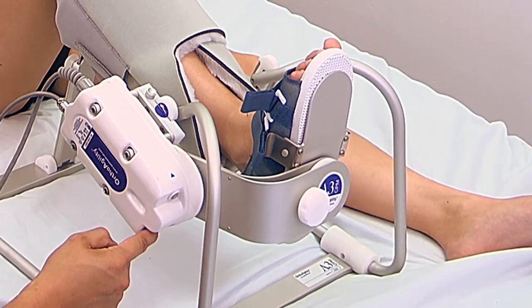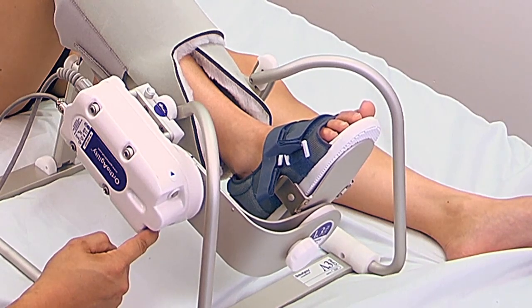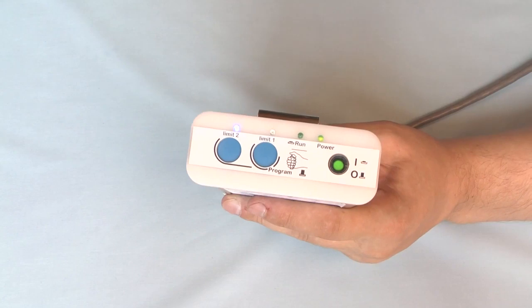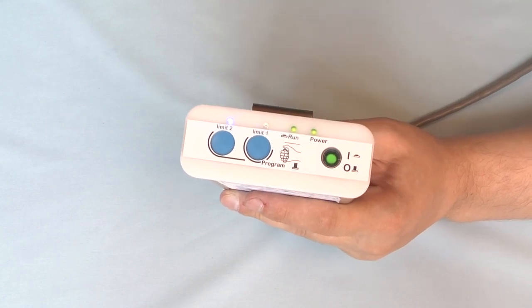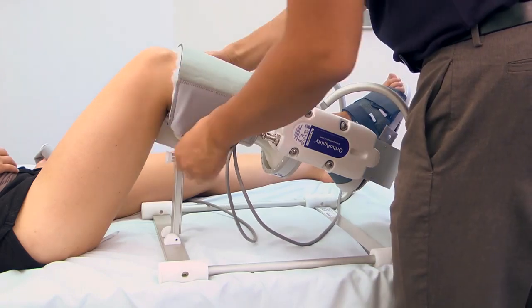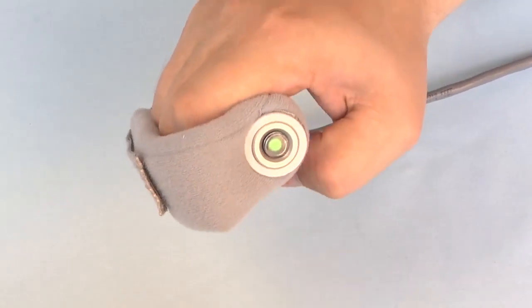Then press the limit one button twice — the blue light will turn solid. With the reverse button, run the actuator to the next range of motion limit, then press the limit two button twice. The blue indicator turns solid. Fasten the soft goods strap around the patient's leg. To begin treatment, run the unit by pressing the patient on-off button.